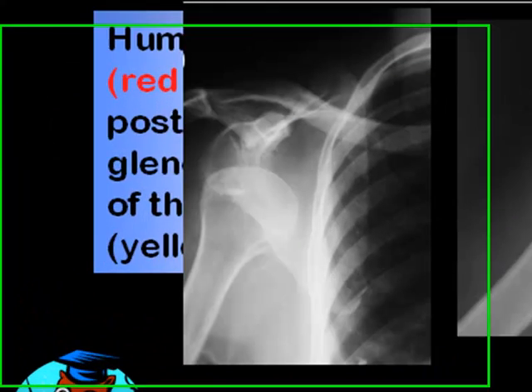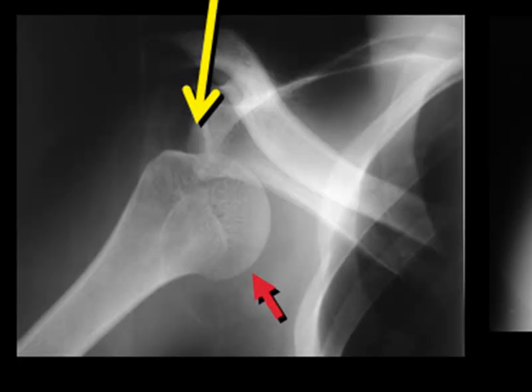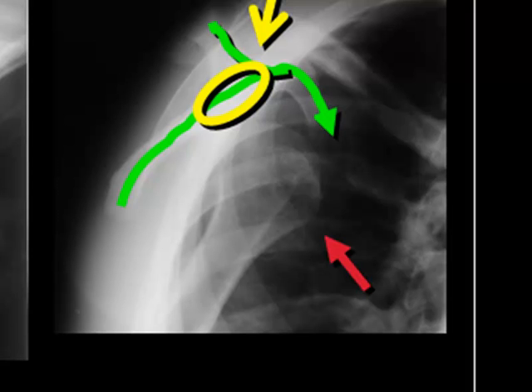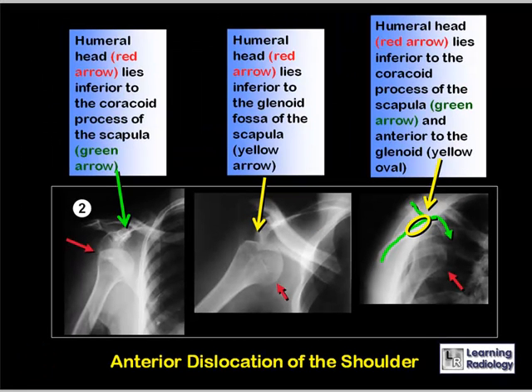In patient two, the humeral head (red arrow) lies inferior to the coracoid process of the scapula (green arrow). On another view, the humeral head lies inferior to the glenoid fossa (yellow arrow). On the Y view, the humeral head lies inferior to the coracoid, which is an anterior structure, and anterior to the glenoid (yellow ellipse). This is an example of an anterior dislocation of the shoulder.